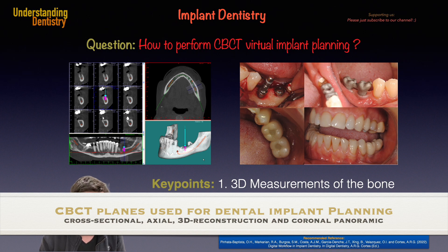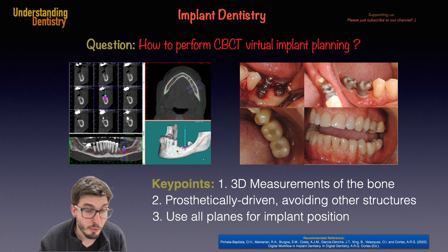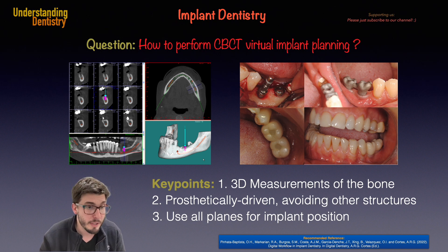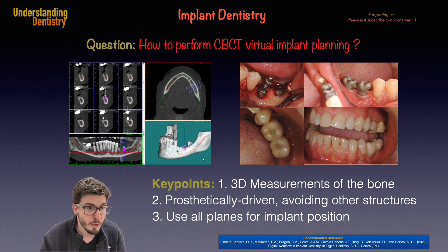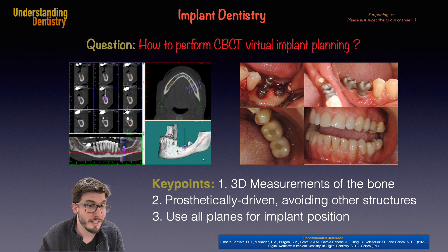On the top right, you have the axial plane. On the bottom right, you have the three-dimensional reconstruction, which is also useful — you can even see the conditions of the third molar distal to the implant with furcation exposure, which would be extracted. On the bottom left, there is an image similar to an OPG called the coronal panoramic view, which is useful to plan implants and assess the mesial-distal distances between adjacent implants or between implants and adjacent teeth.